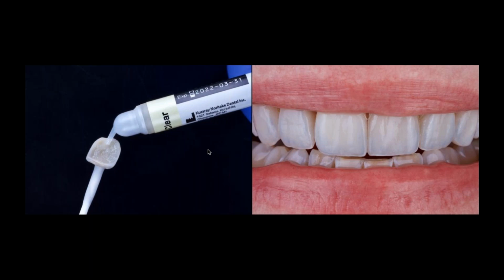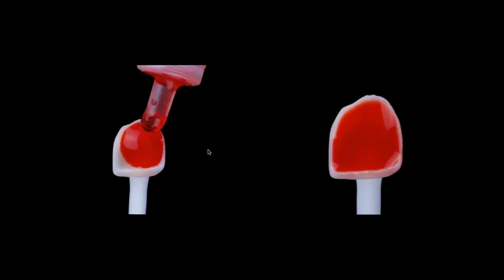Shade selection immediately after finishing the preparation, so we know exactly what we are going to be dealing with, will help us select between the translucent or the high translucent version, and of course be as precise as possible on the value, because at the end that's exactly what we can be more critical of, the gray scale, exactly how bright or how dark a restoration would look.